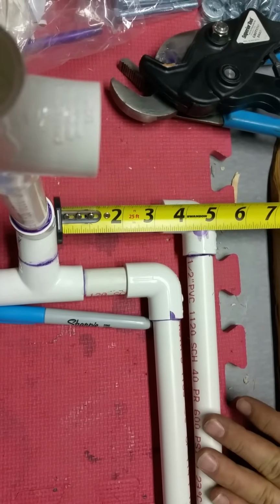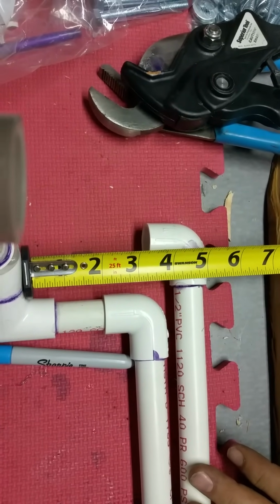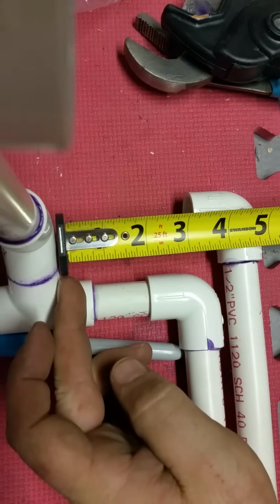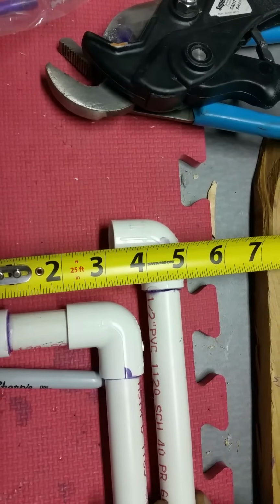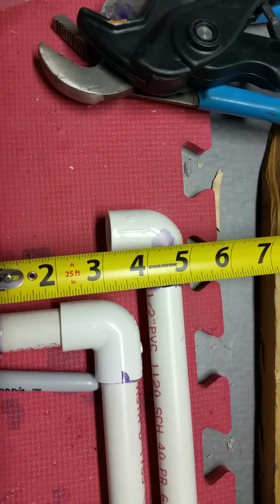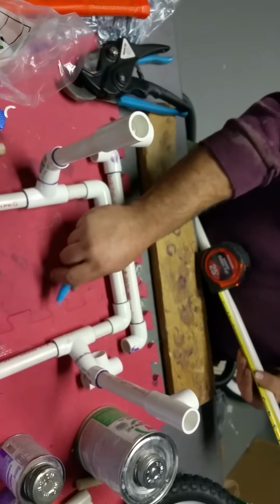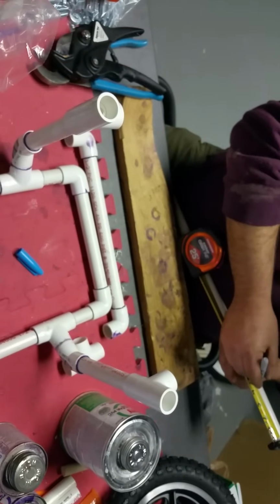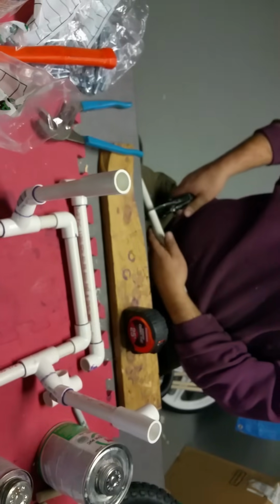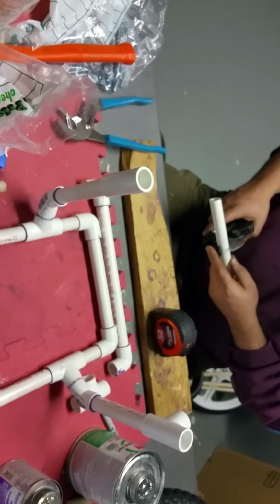Okay, the next step is to figure out how far we need to go from our T connector so that we meet in the correct spot with our bottom support bar. So we're going flat against the back of the leg T to the inside of the 90-degree lower support bar, and we get exactly 4 inches. Please remember as we're going through that this is for this specific cart. Your cart is going to have different dimensions depending on the size of the dog you are building it for. And again, if you're building for a small dog, you don't have to do any of these steps. You're already done.